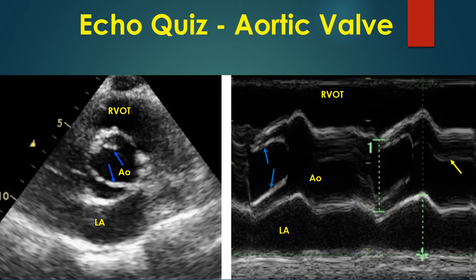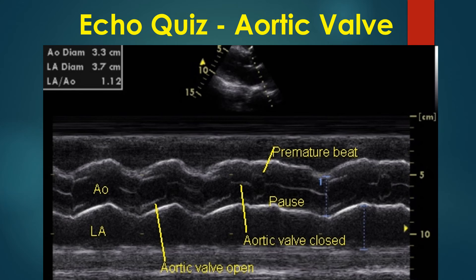The closure line is seen nearer the anterior aortic valve than the posterior valve. This eccentric closure is characteristic of bicuspid aortic valve. The central closure line of a tri-leaflet aortic valve is shown here for comparison. This image also shows a short cycle due to a premature beat and a pause following it.